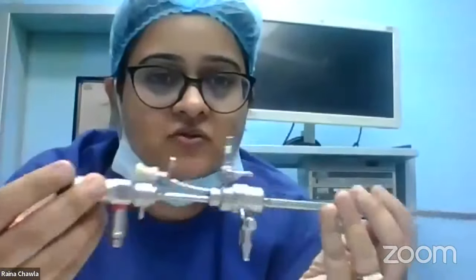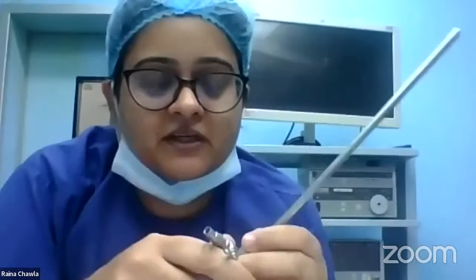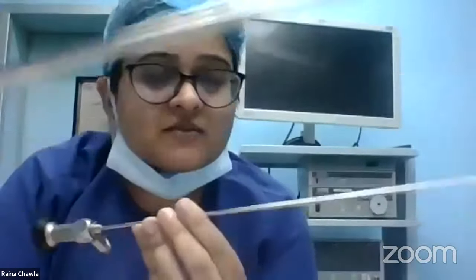Now, the other endoscopy which is important for us is this. What is this instrument? This is a hysteroscope. It again comes with a sheath, and I'll just dismantle this and show you. So this is the hysteroscope. It is similar to how a laparoscope looks. This is a laparoscope and this is a hysteroscope. The only difference is it is much, much thinner. We have hysteroscopes as thin as 2 millimeters or as thick as 5 millimeters, but usually not beyond 5 millimeters, because we just have to introduce this in the cervix to visualize the uterine cavity. So the hysteroscope is to visualize the uterine cavity.